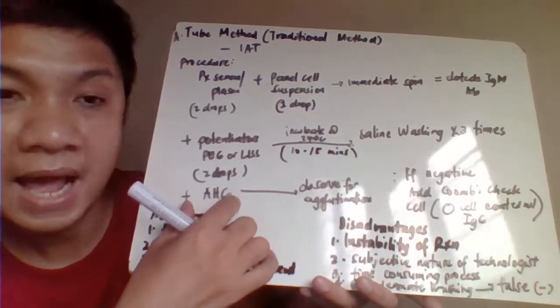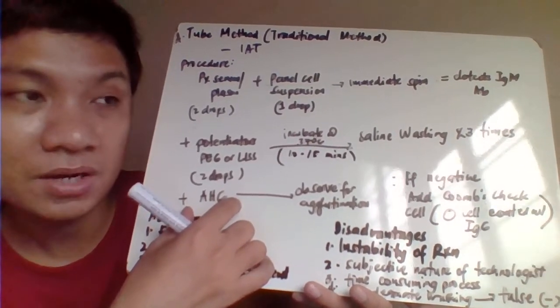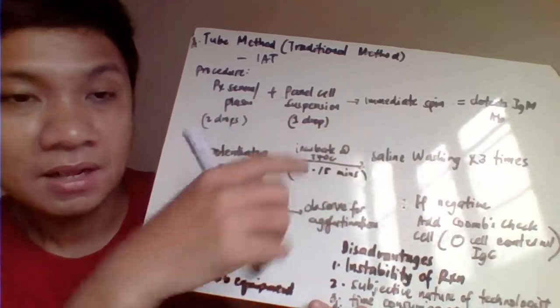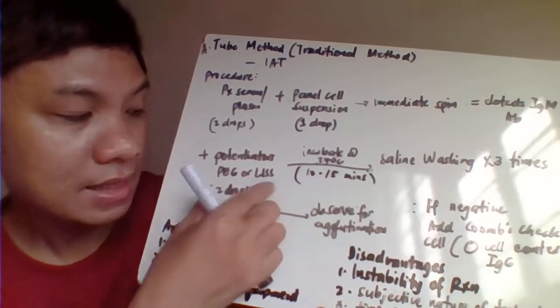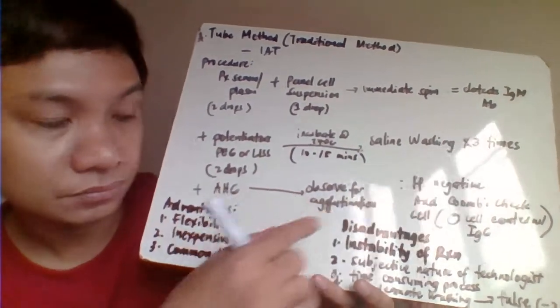Again, this one will enhance. So, pag nagkaroon tayo ng antigen antibody reaction, since like for example, ang serum ni patient ay may IgG antibody corresponding to your red cell antigen here, so attach, and then it will be enhanced by addition of your anti-human globulin para makita mo ang agglutination reaction.